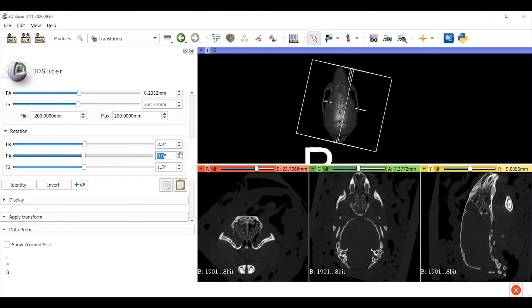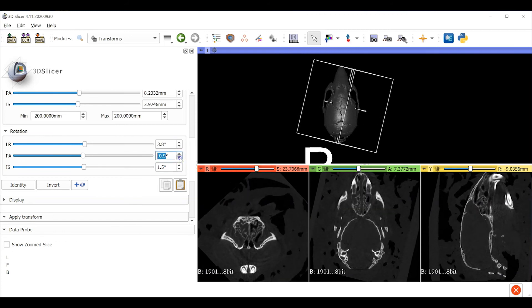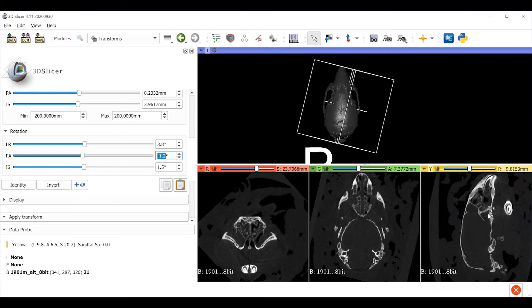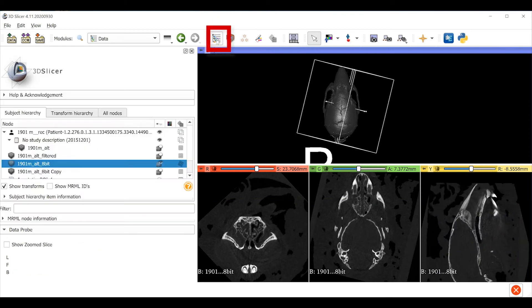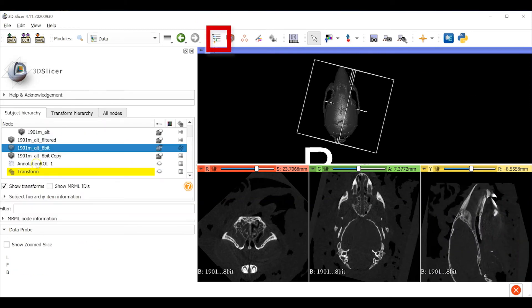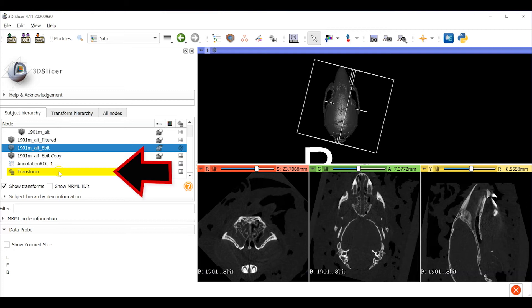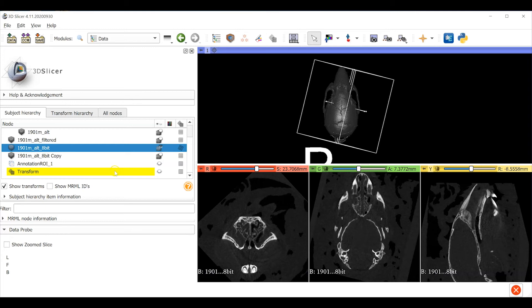When you are satisfied with the transformation of the model return to the data module you can see that there is a transform object associated with the 8-bit object. This yellow highlight indicates that it's in use. Our next step is going to be to re-slice the transform model so that the voxels are aligned with the orthogonal planes of the skull. In the same step we're going to crop out all the extra blank voxels that carry no information about the skull but take up a lot of valuable file space.